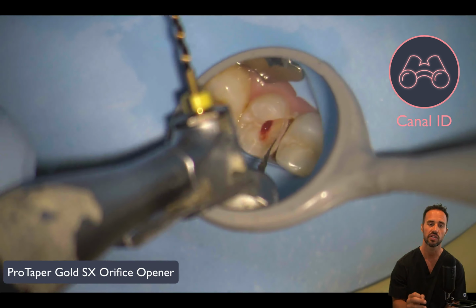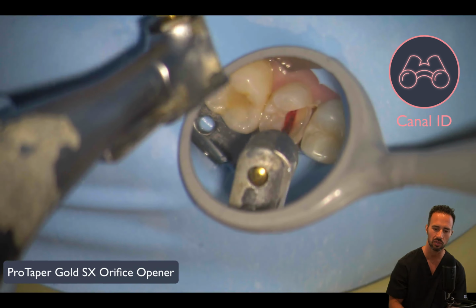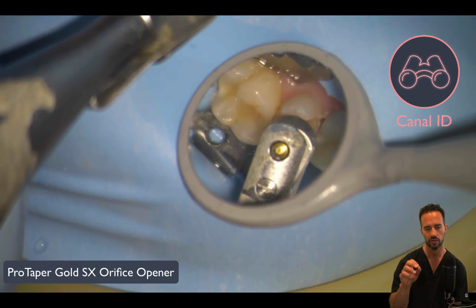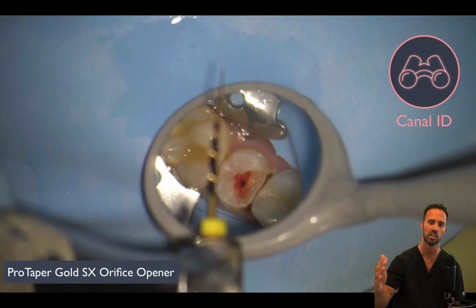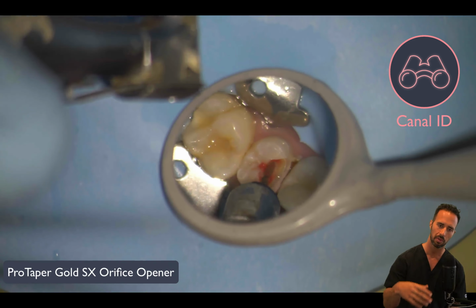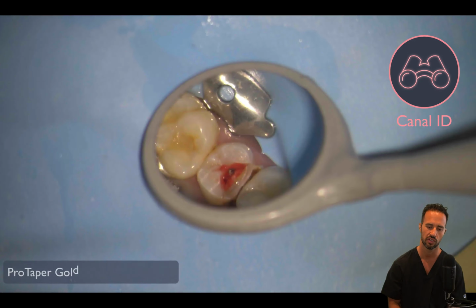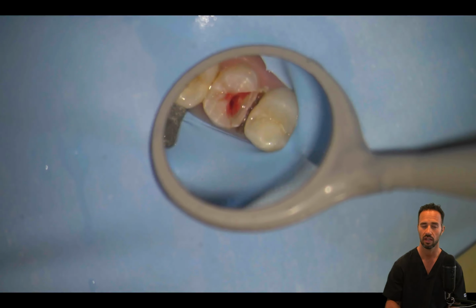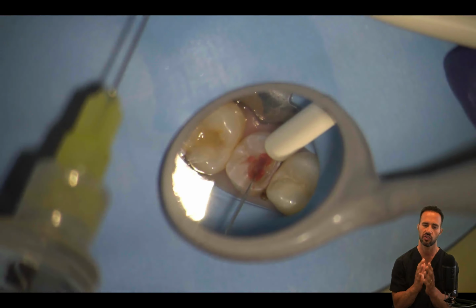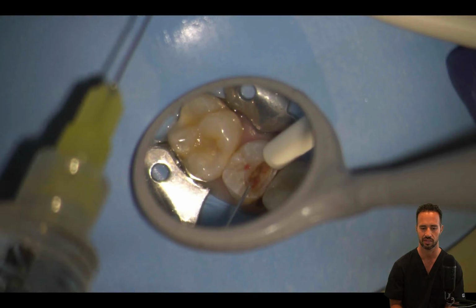So now we're introducing our ProTaper Gold SX orifice opener, and we're just passing it into the buccal canal and then eventually into the palatal canal. And remember, you want to introduce the orifice opener and then do a lot of brushing motions away from the furcation. So in the buccal canal, you're going to brush buccally, and in the palatal canal, you're going to brush palatally. Okay, you're not trying to push this file or any other rotary file for that matter, but you're just trying to make some space coronally and trying to orient yourself inside the case so you can begin the process of instrumentation.